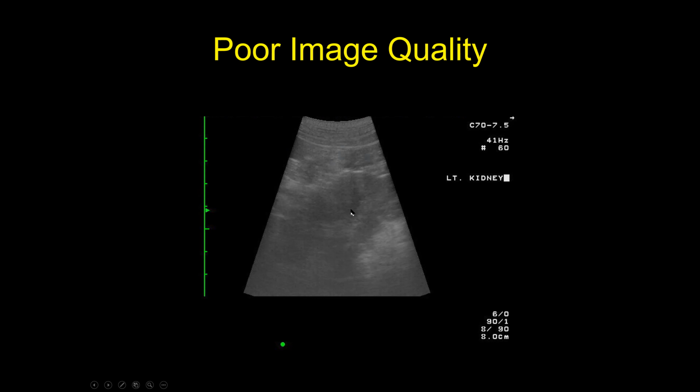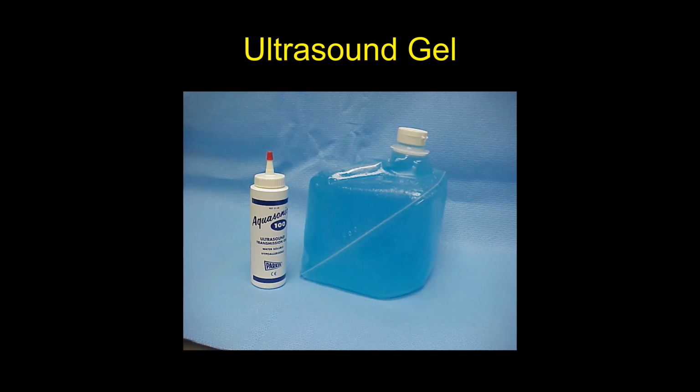And I sure couldn't tell you exactly where on the dog's belly, the abdomen, this probe was sitting. I don't know if it's caudal, ventral, left, right, or whatever. So we have to be really specific with ultrasound. If you get in the habit of doing ultrasounds, always label the left kidney, label what organ you're looking at, whether it's the left side, right side, midline, whatever. Because I can guarantee you, if you come back a year later and you compare and this wasn't labeled, you're not going to remember if that's the left or the right. You might even not know if it's a kidney. So take the time to label the images.